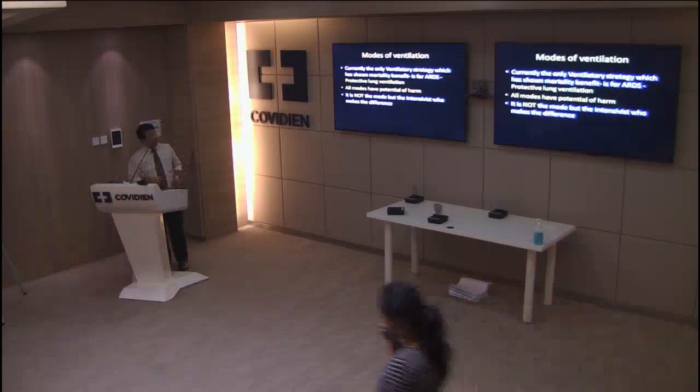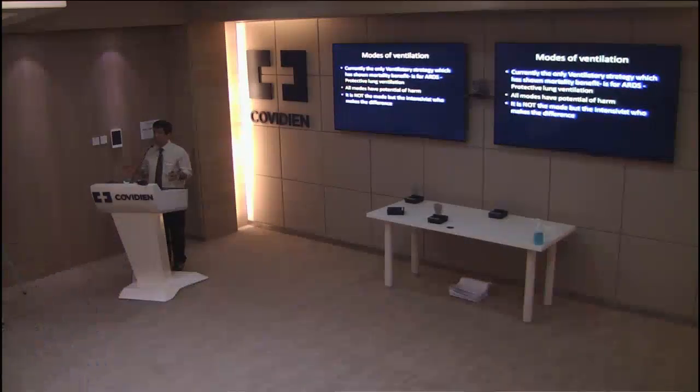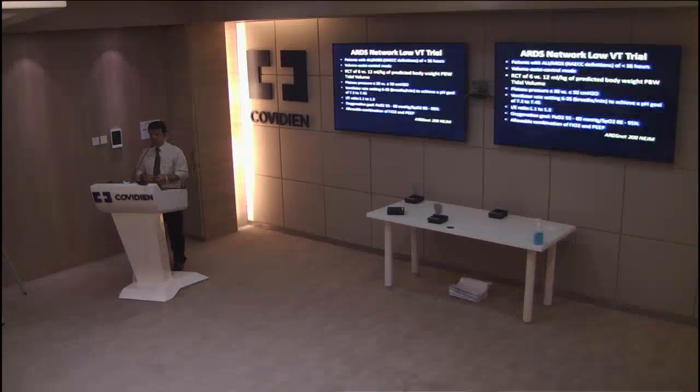Okay, all modes have a potential to harm. It is not the mode which you use that makes the difference, but it's the intensivist, the person at the bedside, and how intelligently he's going to use that mode that makes the difference. And there was no other person better than Dr. Hegde who sort of alluded to that in the talk previously.